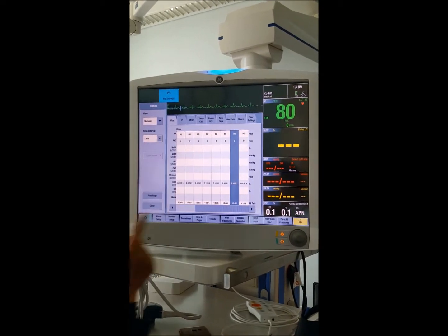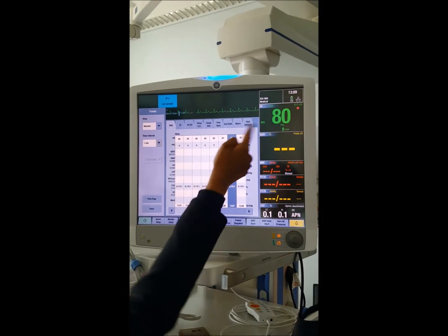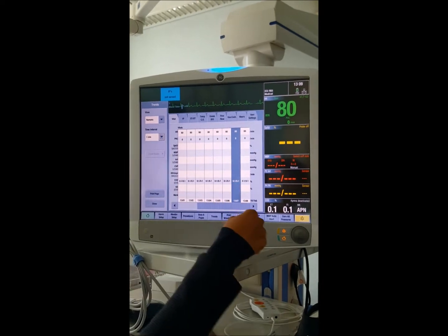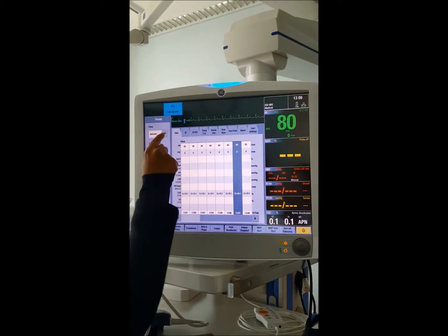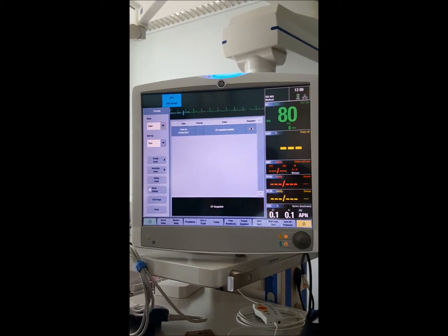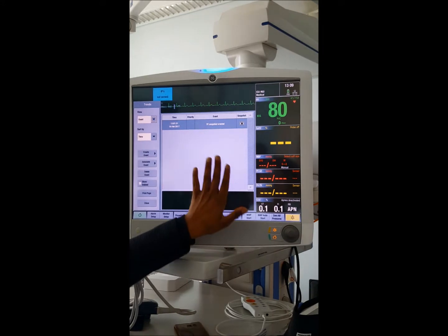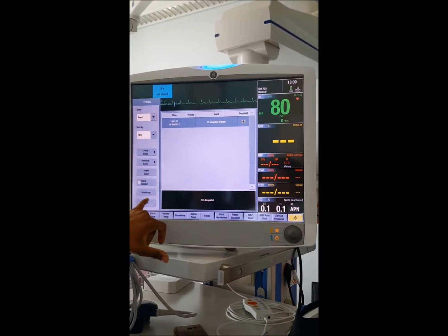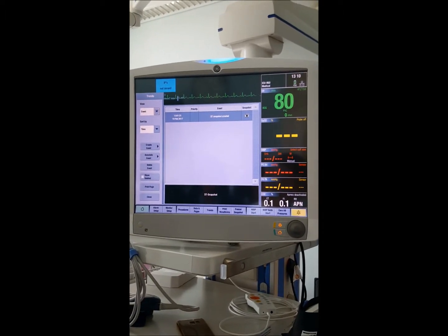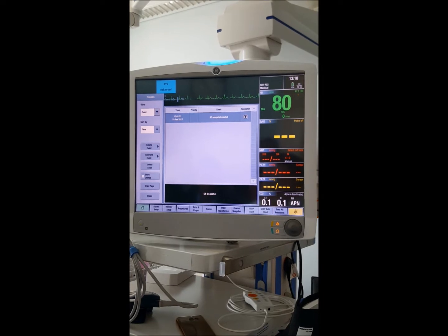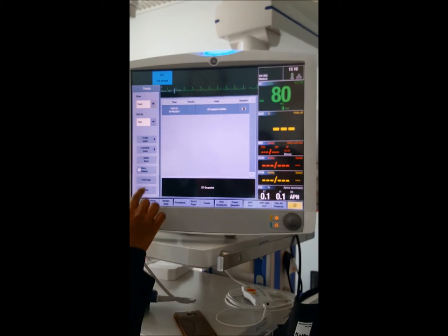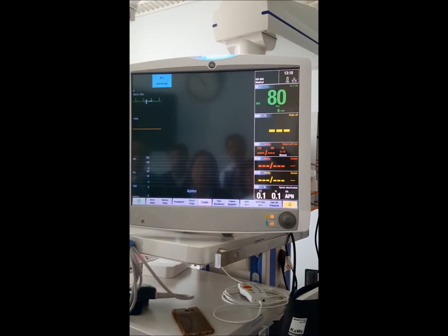If the patient is very critical, set the time interval to one minute so readings are stored every minute. After trends, there is something called Events — any tachycardia, bradycardia, asystole, or any event happening to the patient is automatically recorded. You can print it at any time from the central station. The event directory records things like low SpO2 or high heart rate.